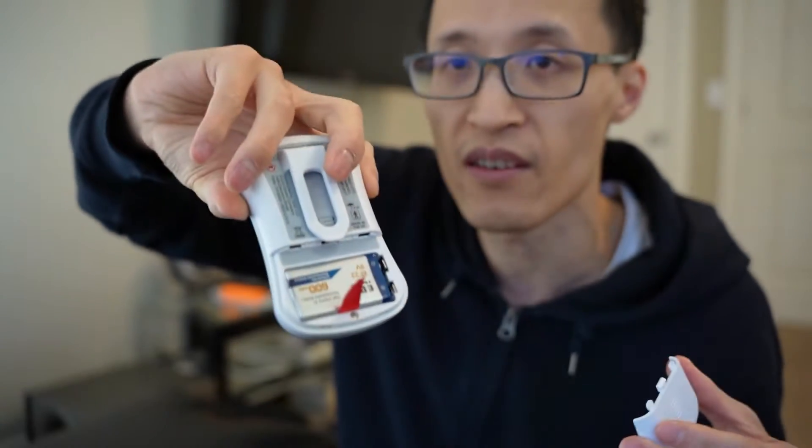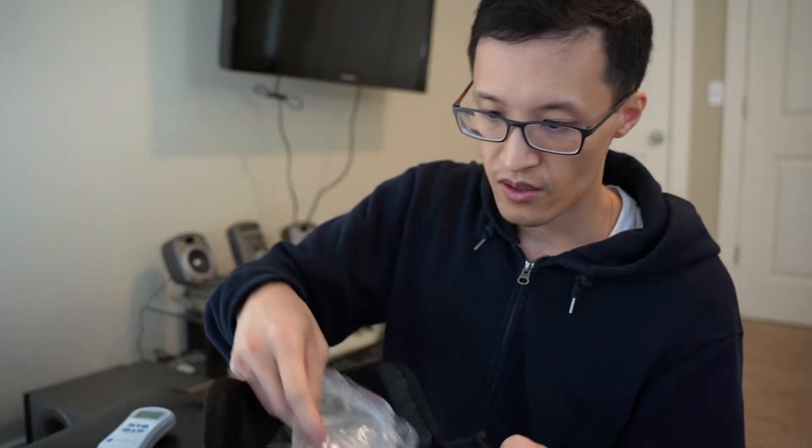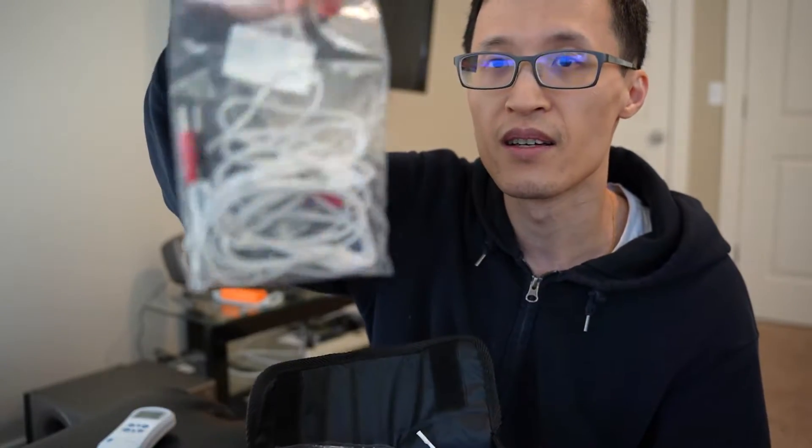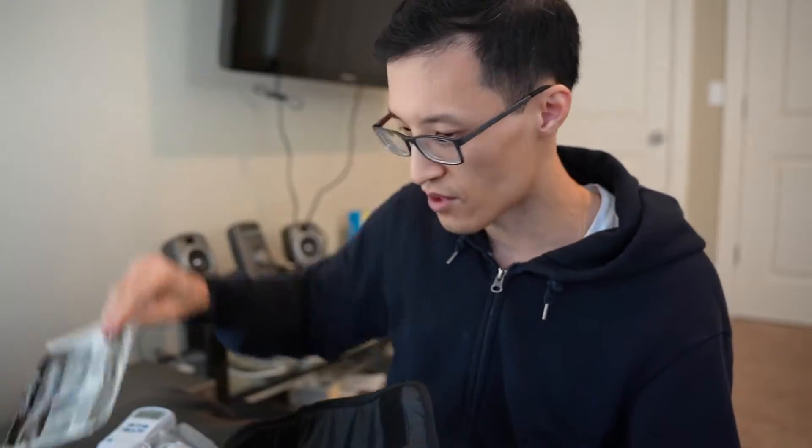You have a back clip on the back. It's powered by a 9-volt battery underneath here. You have a manual that comes in it. You have your leads, and then you have your pads to attach.